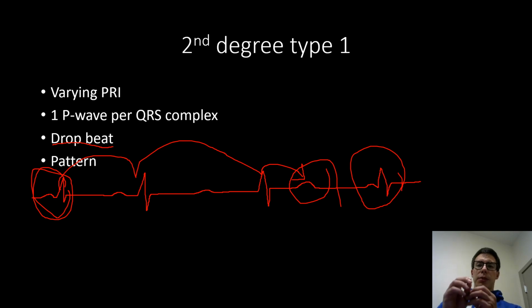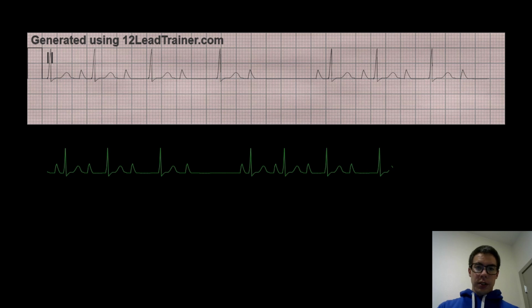But then problems start again, they start to distance, then they break up. Then they go back to the same bar, see each other, wink, and back together. So it's just that pattern of distancing and then coming back. So that's just a story I heard for it, and it helps me remember it. So this is an example of that. So right there we have our P wave, and we can look at the PR interval here.